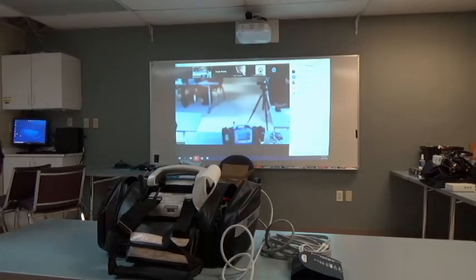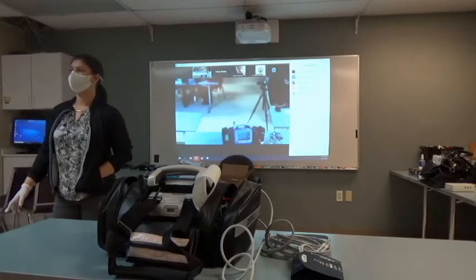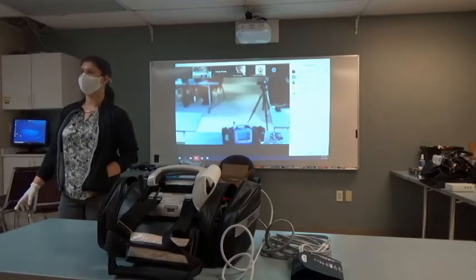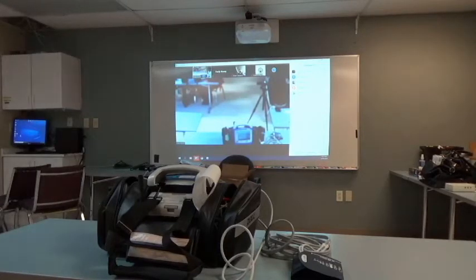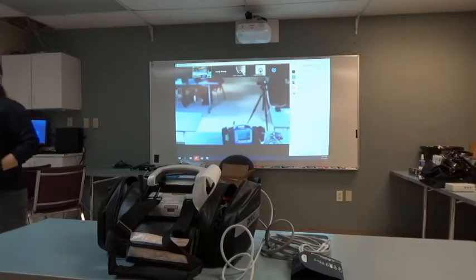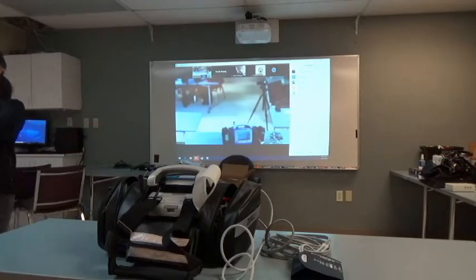Everybody good? Excellent. No? Hold on, I missed it. Hang on, I hit the back button. That's okay. Are you reacquiring? Yes. Can you reacquire and not have a print? You can hit the roll of paper and it'll cancel the print but still acquire and save.